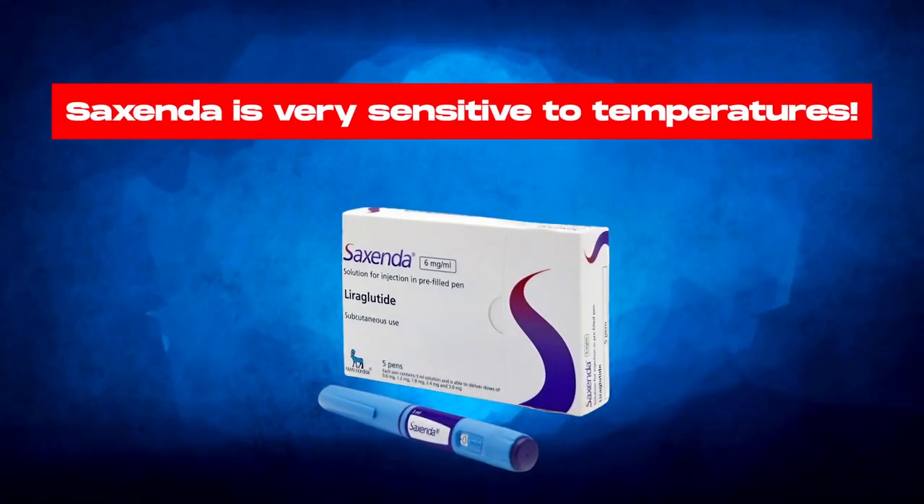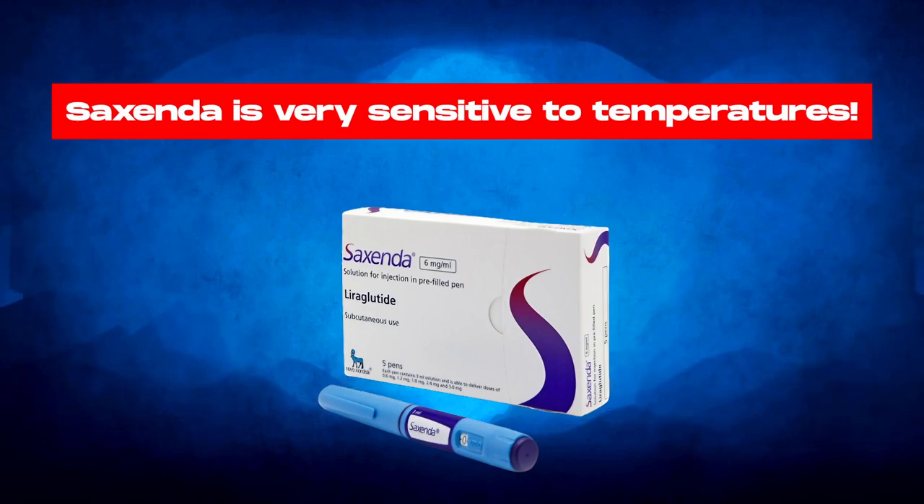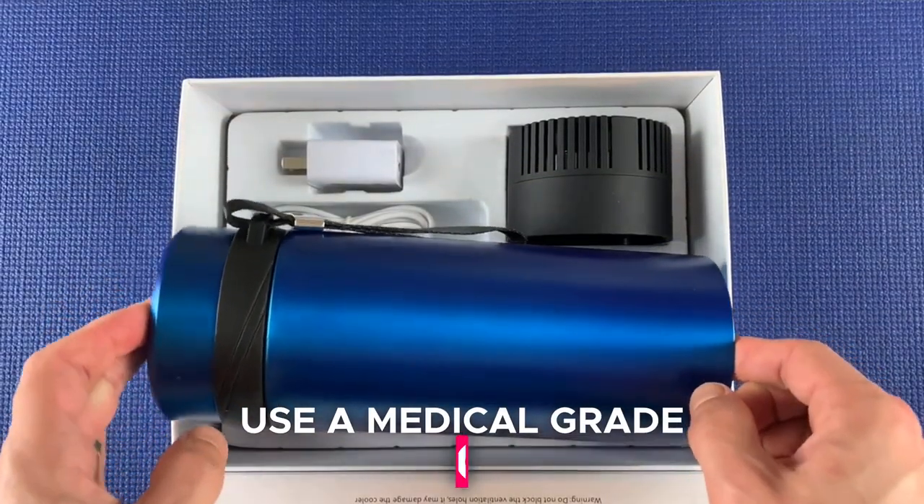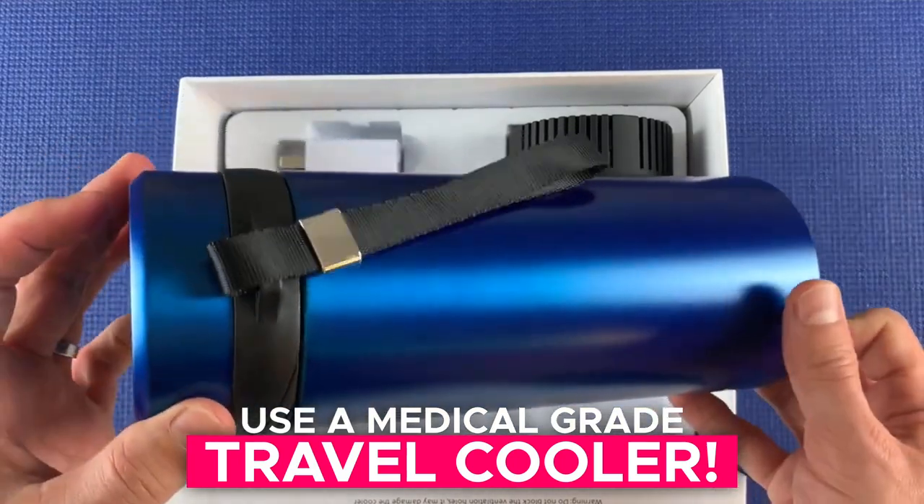Don't forget that Saxenda is very sensitive to temperatures, so make sure to keep your Saxenda pens stored at the right temperature and always carry them in a medical-grade travel cooler to guarantee their full potency.